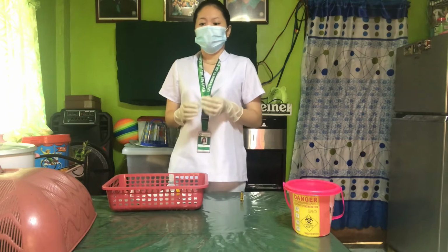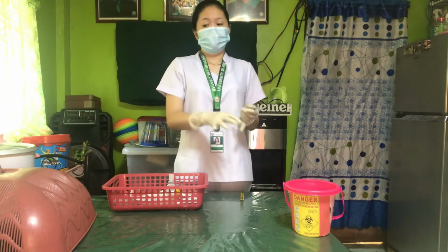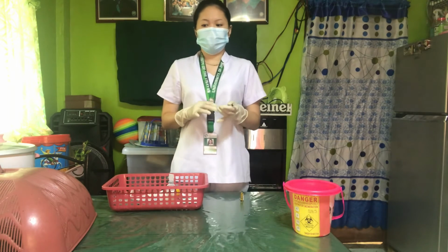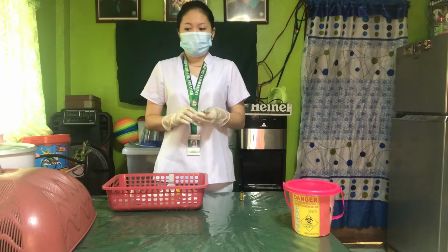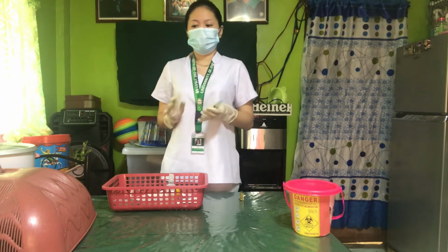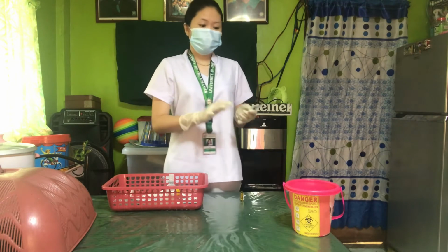Next is dispose the filter needle by placing it in a sharps bin container. This is to lessen the risk of needle sticks, cuts, or punctures from loose sharps. Now I will get the cap of the filter needle again and I'm going to remove the filter needle. Now I'm going to dispose it in a sharps bin.